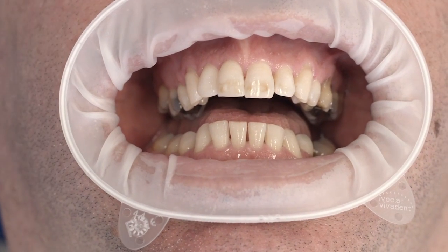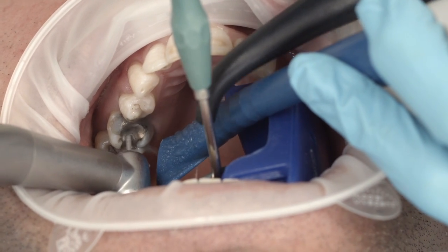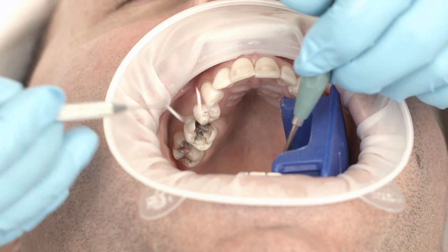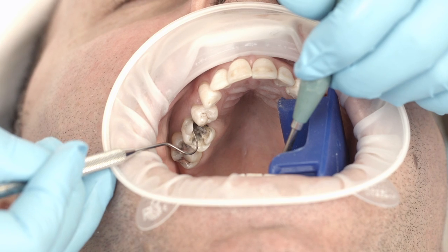After you have placed an Obtrogate Lip and Cheek Retractor, remove the defective amalgam filling. The cavity should provide adequate retention. As you will not be using an adhesive, you should not bevel the enamel edges.